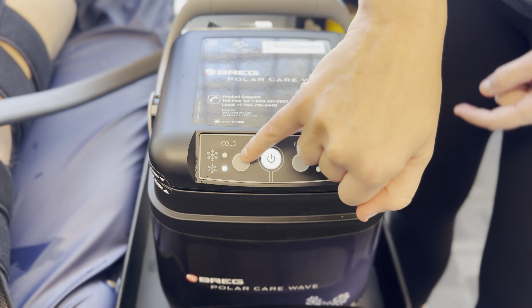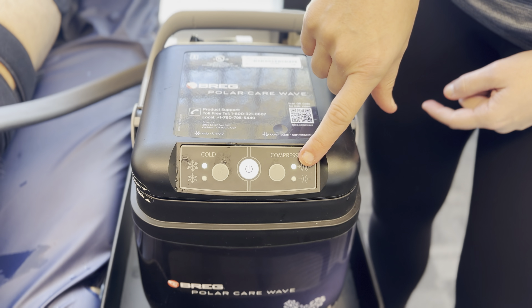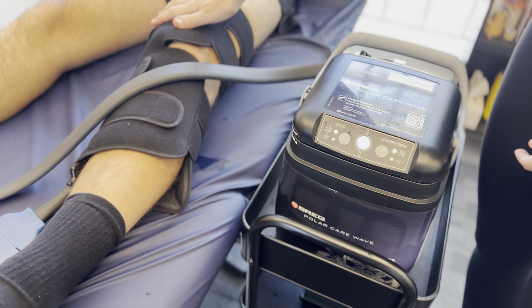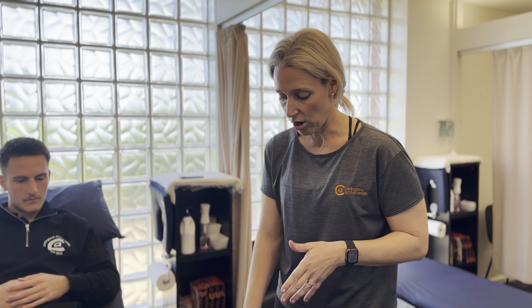We do recommend — if you press the button here, it swaps between the colder option and the higher compression option if you can tolerate it. Once you've done that, you should now be able to hear it inflating and the cold water cycling through. This machine does not automatically turn off after a certain time period, so go with your physio's recommended advice — up to 15 minutes, max of 20, before I would definitely say give it a break and take it off.